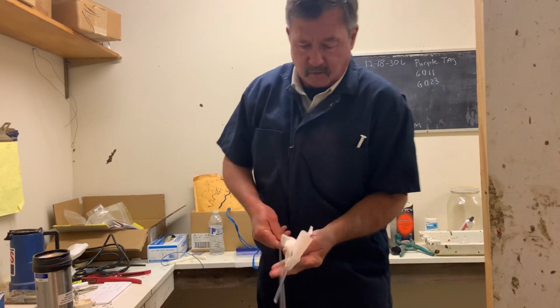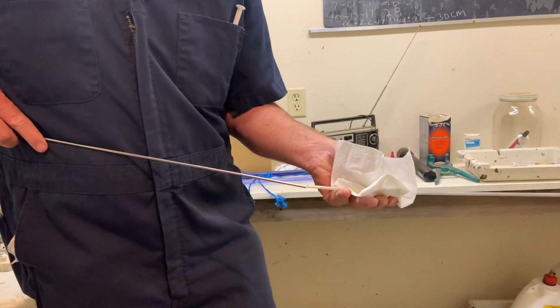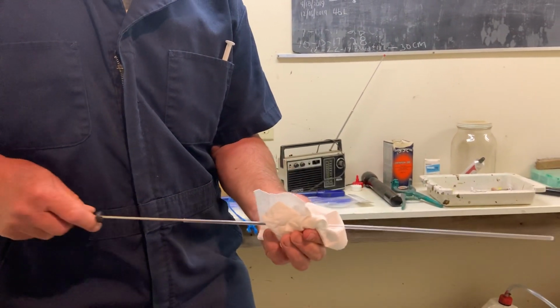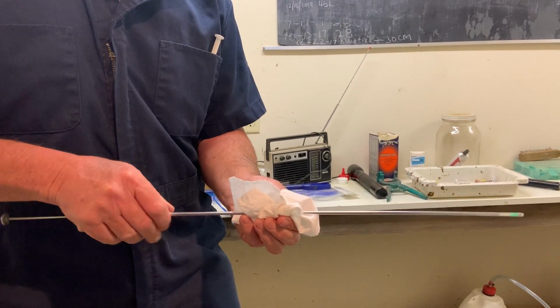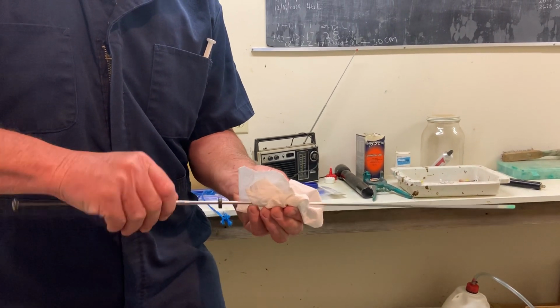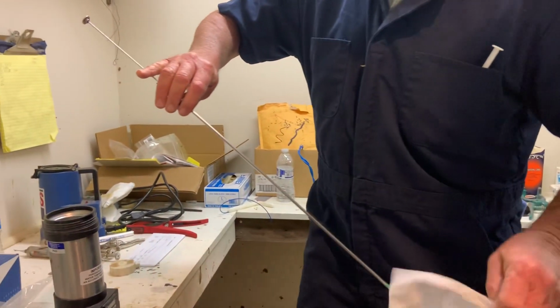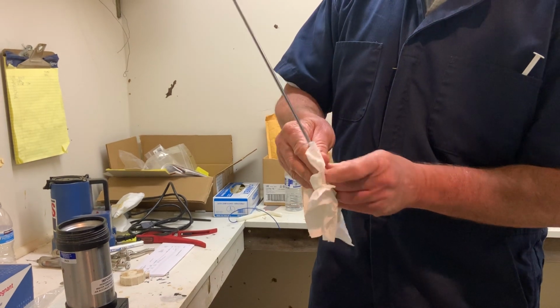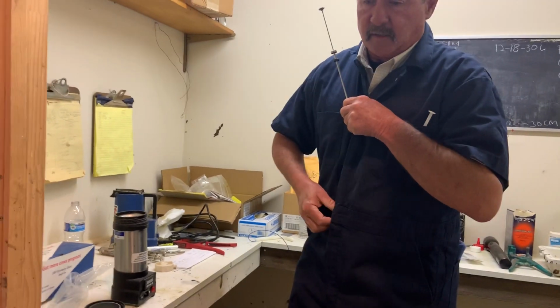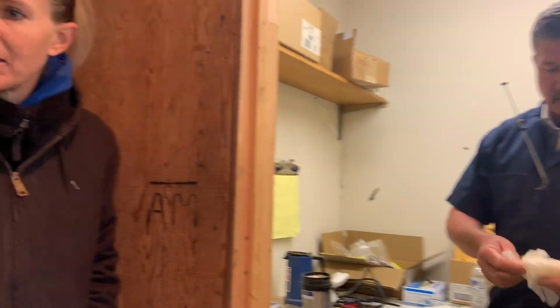And then we'll pull our plunger back and slide the gun into the sheath but over the straw. So now the straw is actually inside the gun and the sheath goes on the outside of the gun. And the end of the sheath has a little split in it down here, so we can snug it on there really tight and then put that little donut hole ring over it. And what that does is that keeps the sheath from sliding off. And we wrap our tip to keep it warm and protect it. And then we put it back into a warm area until we're ready to put it into the cow. So at this point we can go ahead and put the cow into the squeeze.